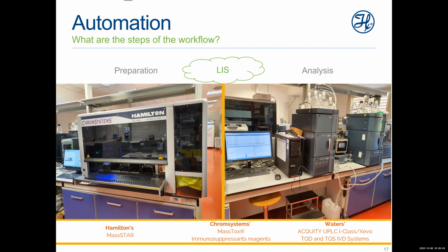So we are going to have a process from the sampling of the sample, when we start the preparation, to the final report, all connected with digital data without the need of the operator to enter anything.